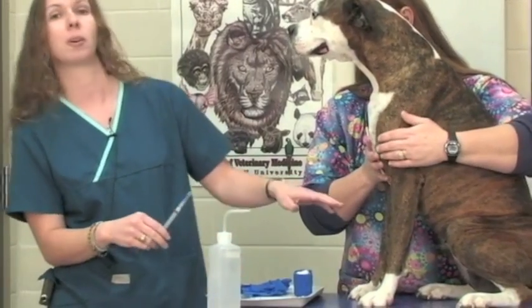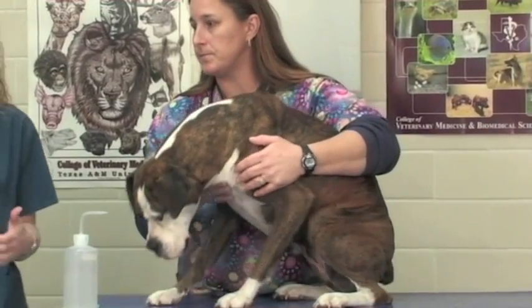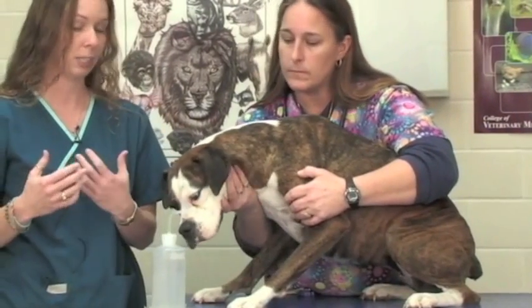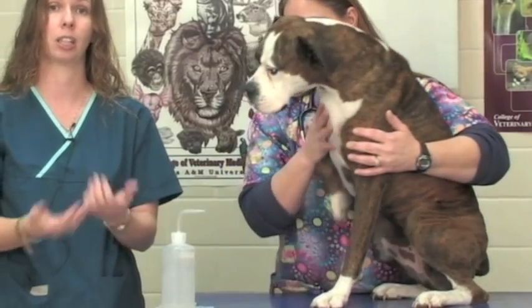We're going to draw a small sample from Winn-Dixie just to show you what the procedure is. It is a good idea with any patient when you're going to be handling any bodily fluid to place exam gloves on, because you never know what the history of your patient is when they come in, especially if they're a good Samaritan. If someone just finds a dog on the street you always want to wear gloves to protect yourself against anything that your patient may bring into your clinic.